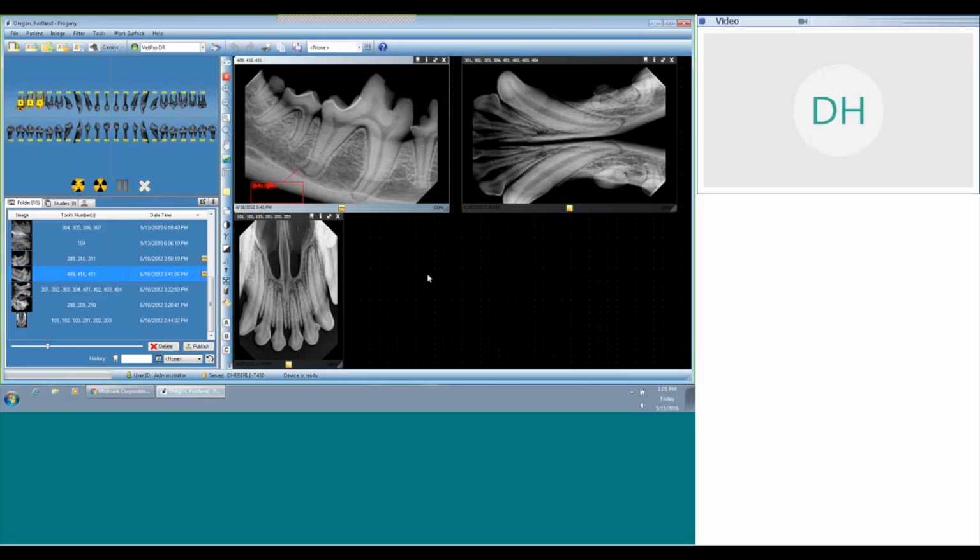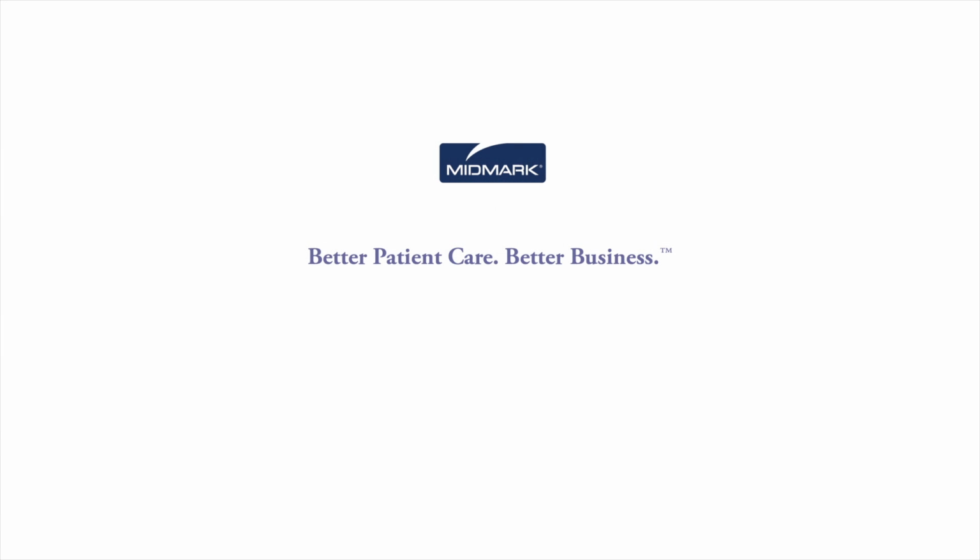So that brings us really to the end of this software. If you have any other questions, feel free to reach out to either myself or call 1-800-MIDMARK and follow the prompts to Progeny or imaging technical support. We also do provide in-clinic positioning training and software training.